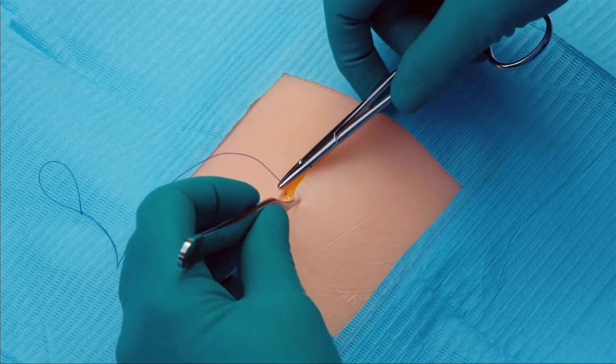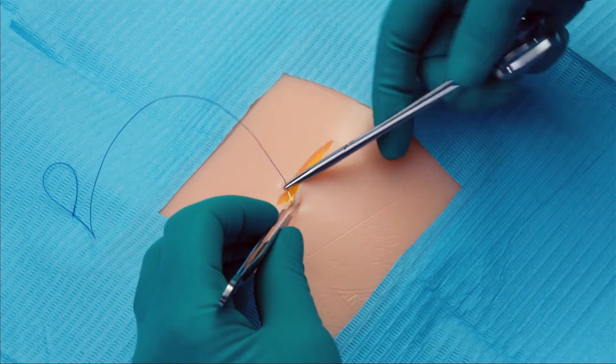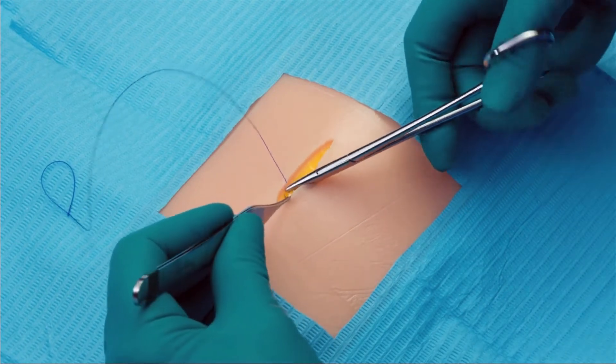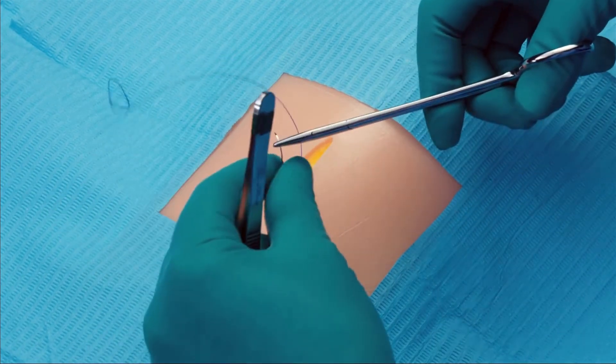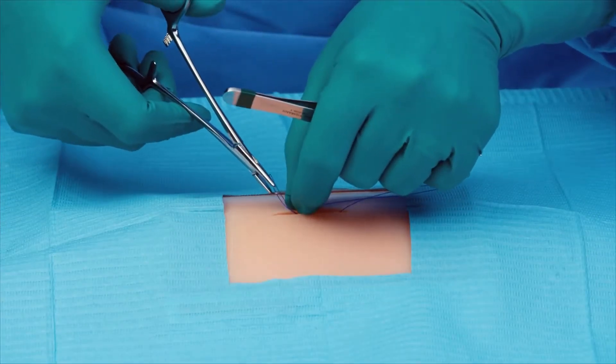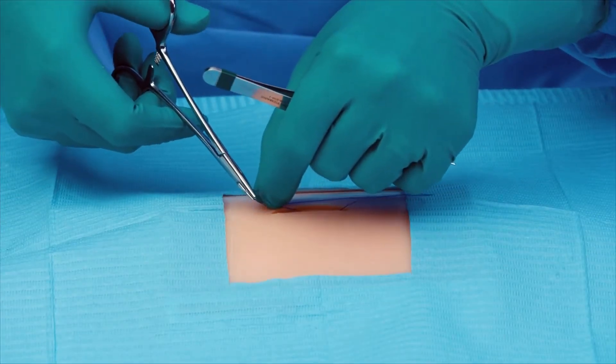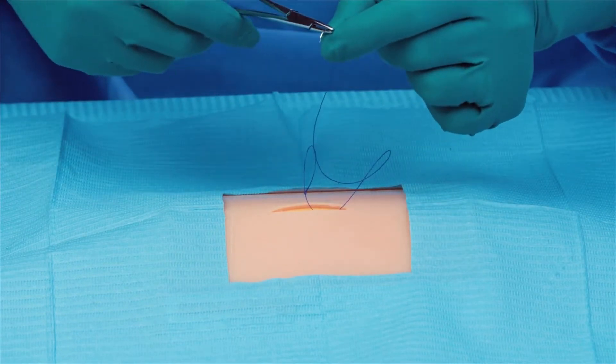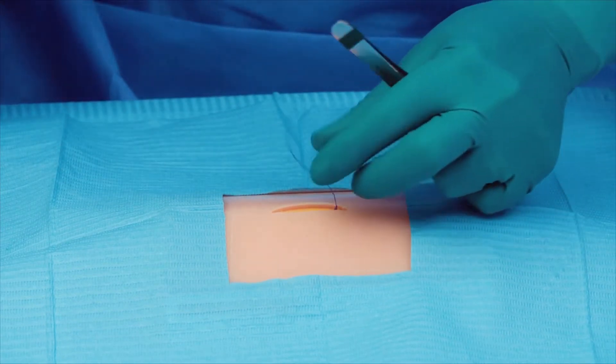We begin by taking a bite of the designated anchoring tissue medial to the apex of the excision. Pass the needle through the variable loop and pull in order to tighten the loop and create the fixation point.